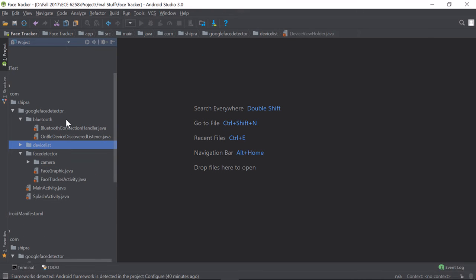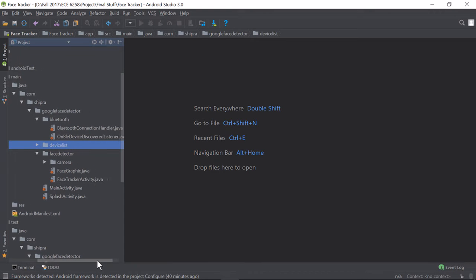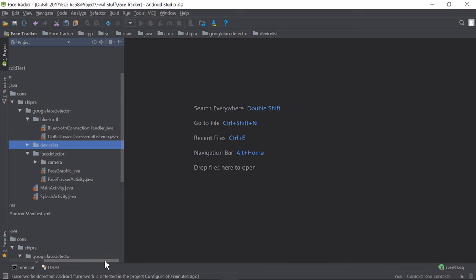Under the folders that we'll be providing, you'll need to go down to the src and come down to the folder saying Google Face Detector. We have used the Google Vision API for actually implementing the basic outline of the code. It helps us in many ways: getting the camera functionality running, and making the implementation of the algorithm much easier when we try to detect faces, compared to probably using Python or something else on an Android phone.